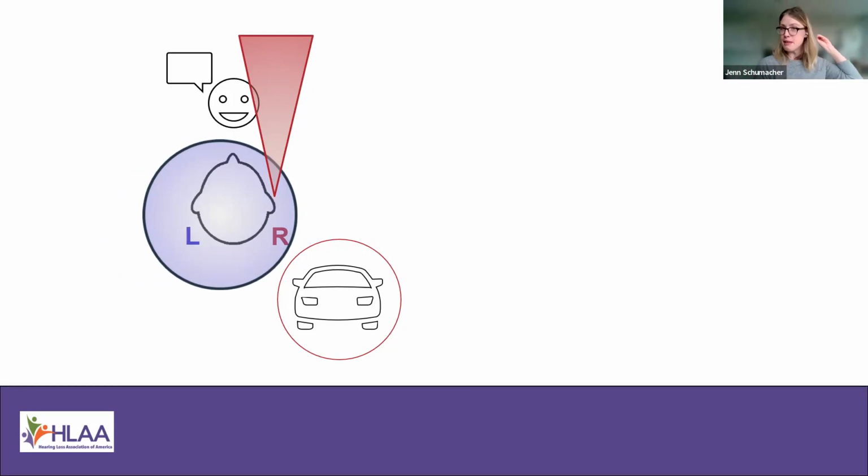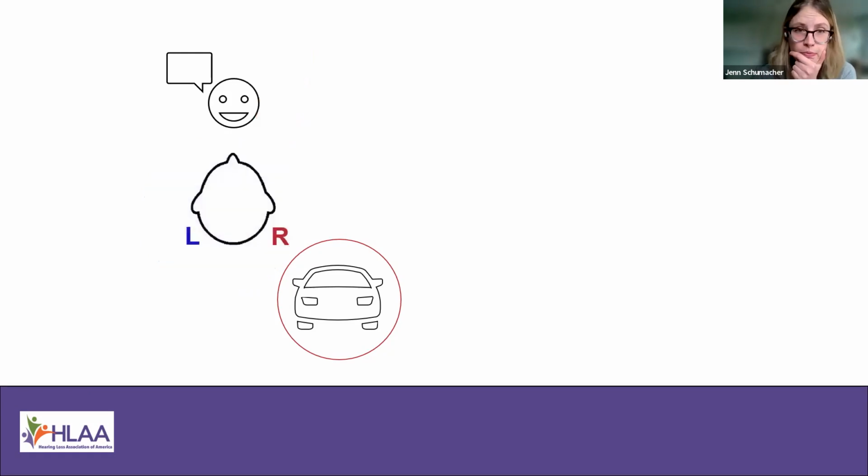So you're still always going to miss out a little bit behind you. But now we're able to actually stream sound between the two hearing aids using wireless technology, and it helps fill in that gap. So that's one thing we think is healthy, because it's actually giving you better awareness behind you than we ever have had before.